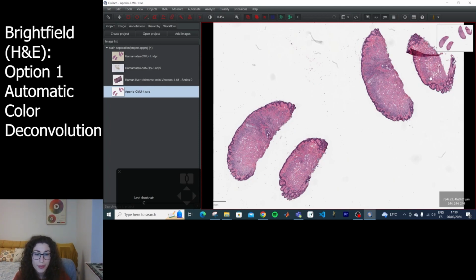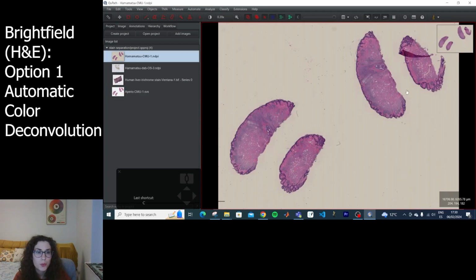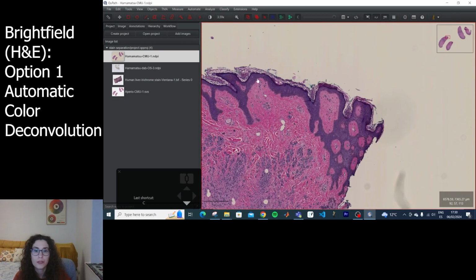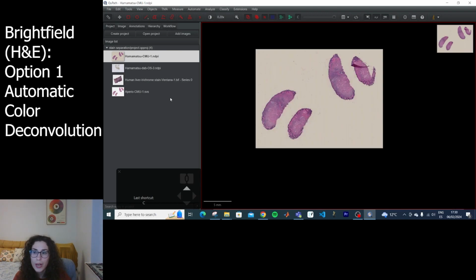You can see that this is very white and bright, and this other one is much more subdued, more creamy. That's because they have different ICC profiles, and I wanted to see if they have the same stain separation vectors, even though their color information is probably not the same. What happens if you just apply the same vectors?